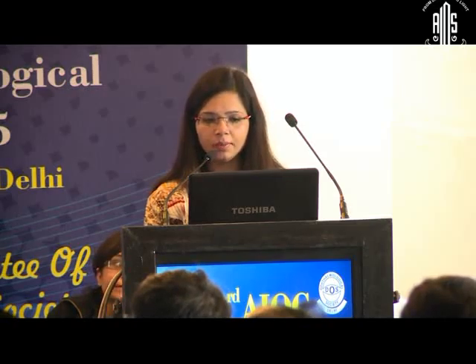This is a small clip in which one is doing phaco and a PCR is noted during phacoemulsification. You can just see with this red arrow there is a PCR noted. The chopper is gently removed from the side port. However, the phacoprobe is in the anterior chamber, and with the side port again we are injecting OVD to push back the vitreous and reinforce the rupture site, and after this one can safely remove the phacoprobe.